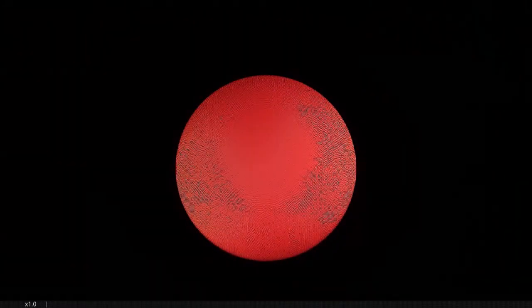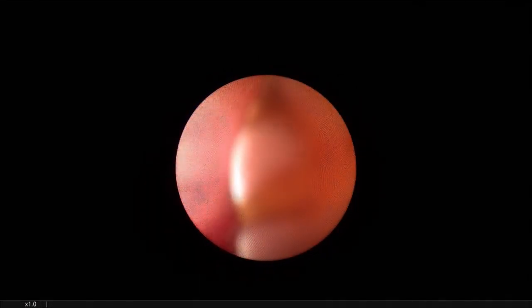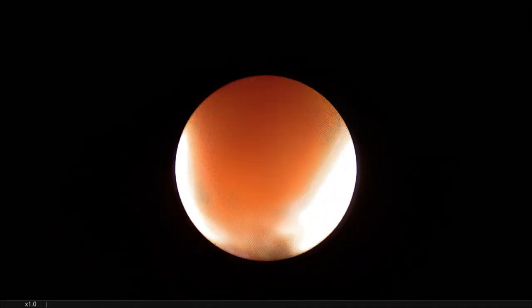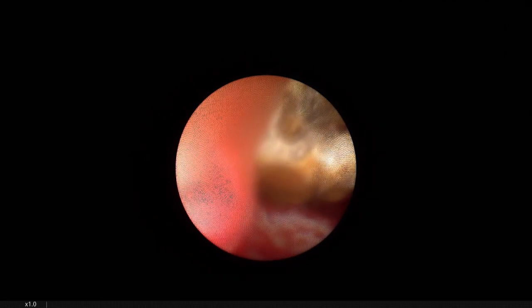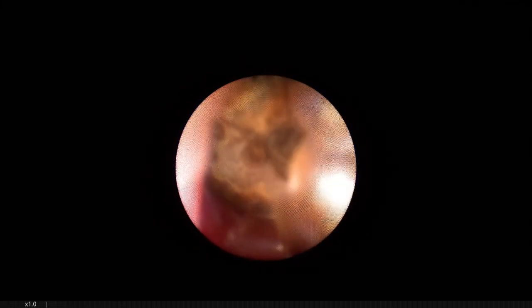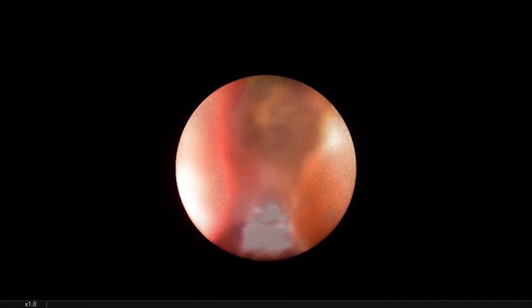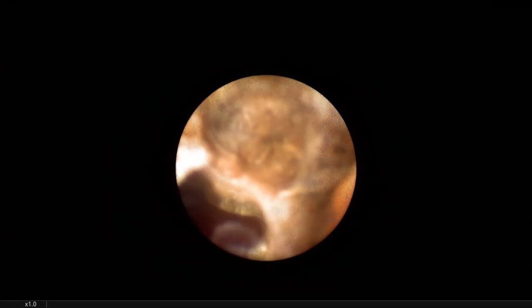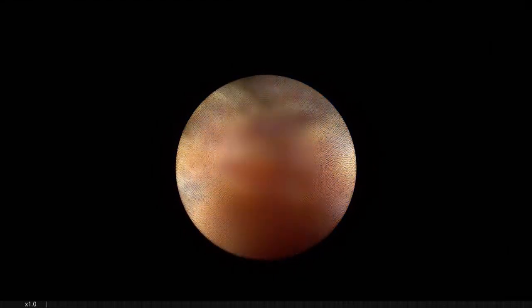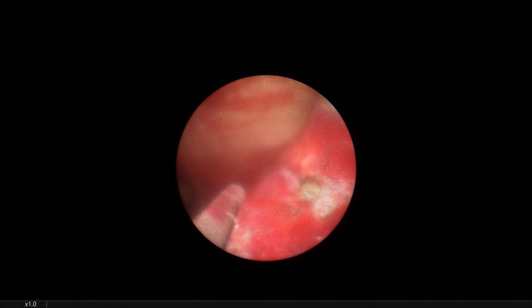No, this is a problem of the 3-chip camera. You don't think the laser fiber is very close to the scope? It said if there is no danger. So close, it's okay. Let's move to the pelvis. Don't move to the pelvis.